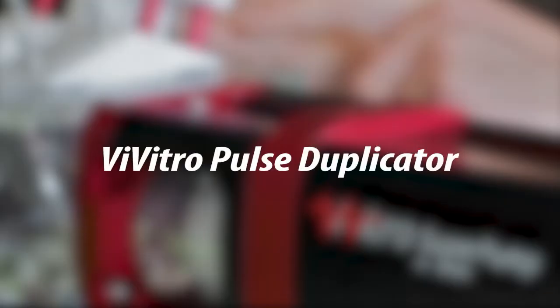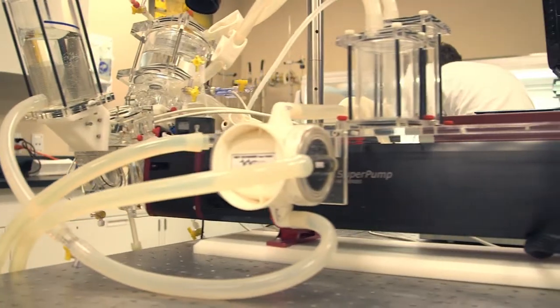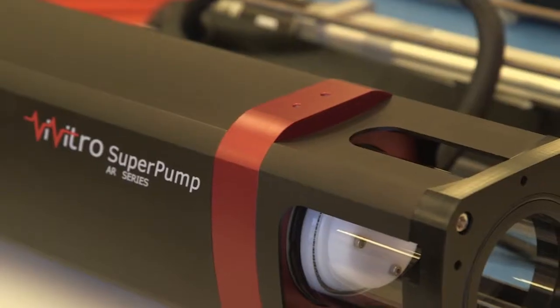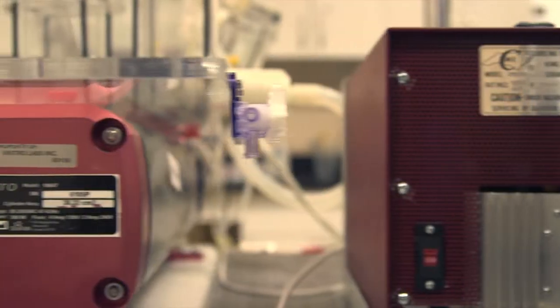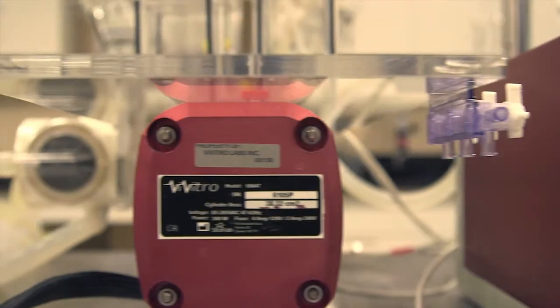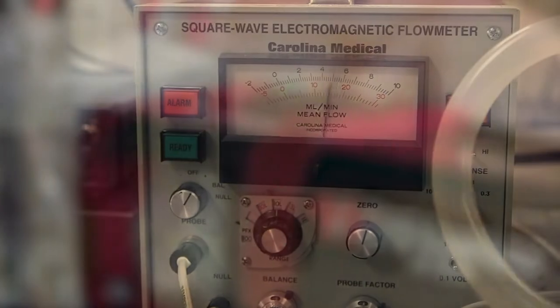The Vivitro Pulse Duplicator is the world's first and most widely used heart model. Composed of the Vivitro Model Left Heart, Super Pump, and Vivitest Data Acquisition System, the components work together to enable hydrodynamic testing that determines valve performance and acts as a physiological heart model.